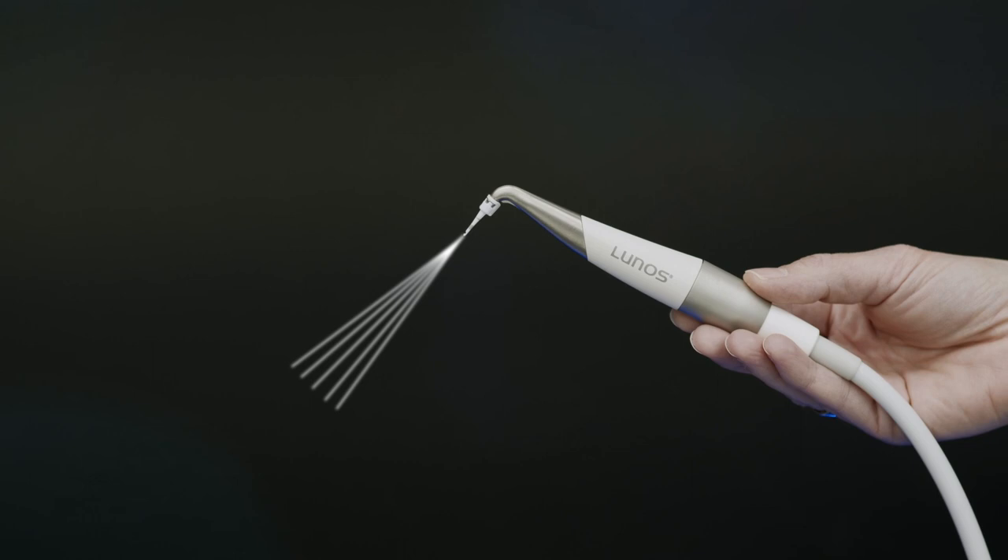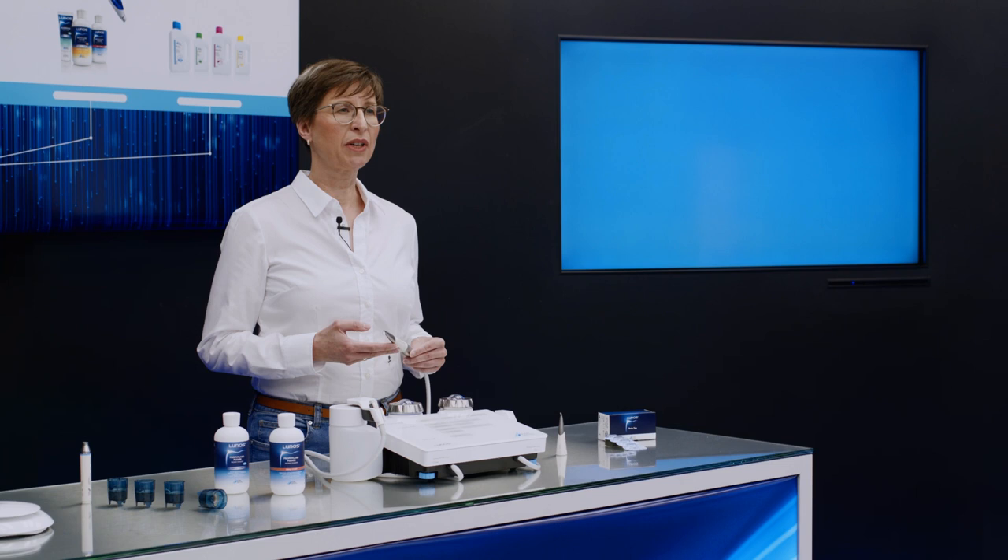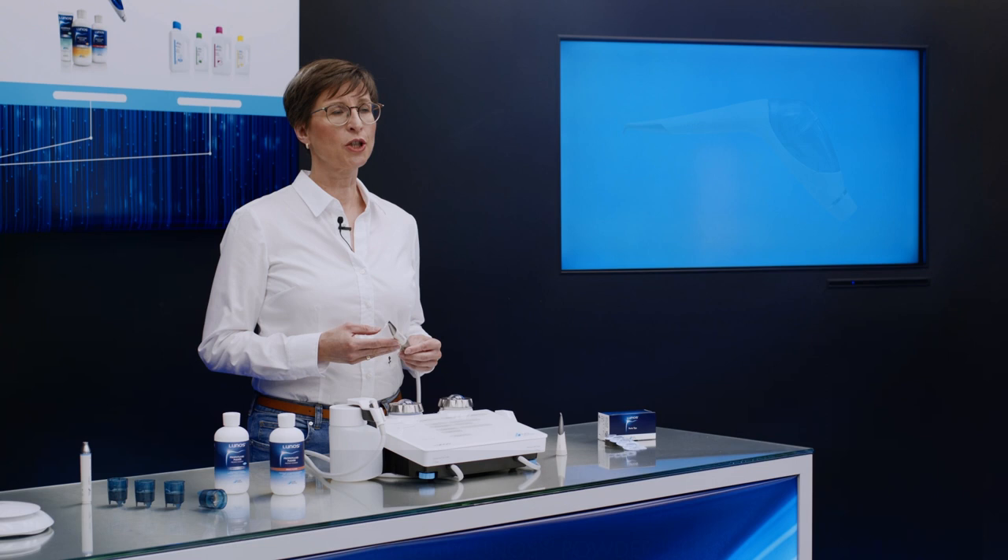One special feature is the permanent airflow through the powder jet handpiece, which reduces the risk of blockages. Also unique is the fact that both powder jet nozzles are compatible with our MyLunos powder jet handpiece and can therefore be switched between the two devices as and when required.